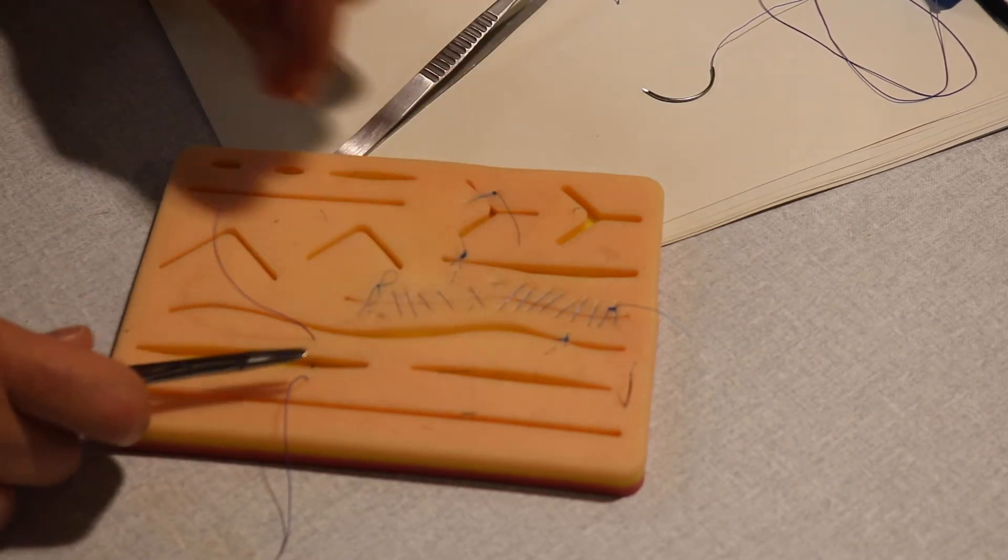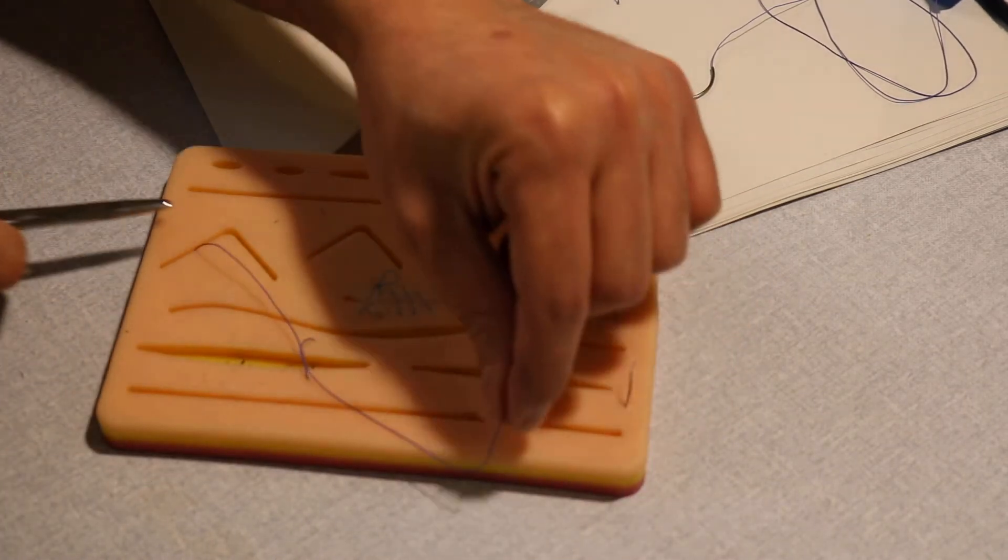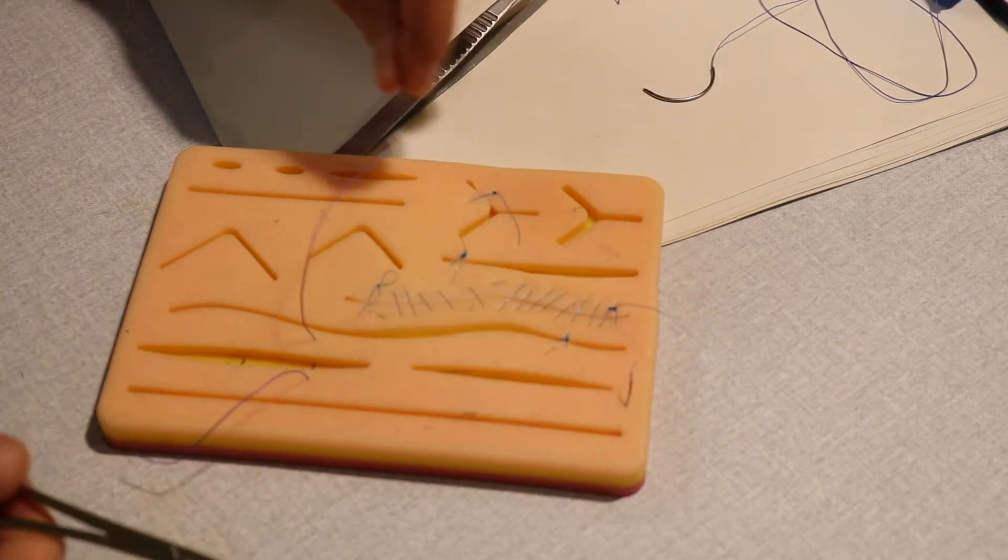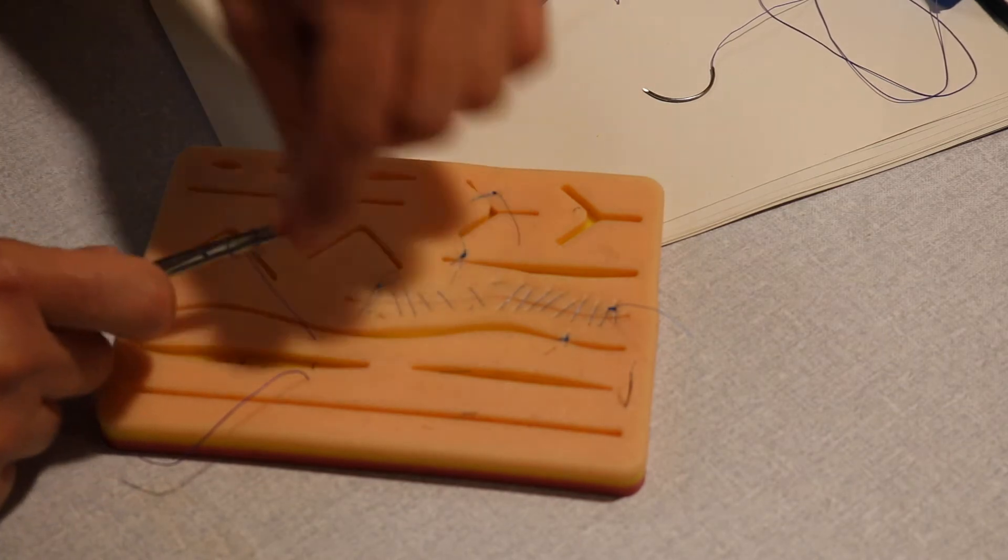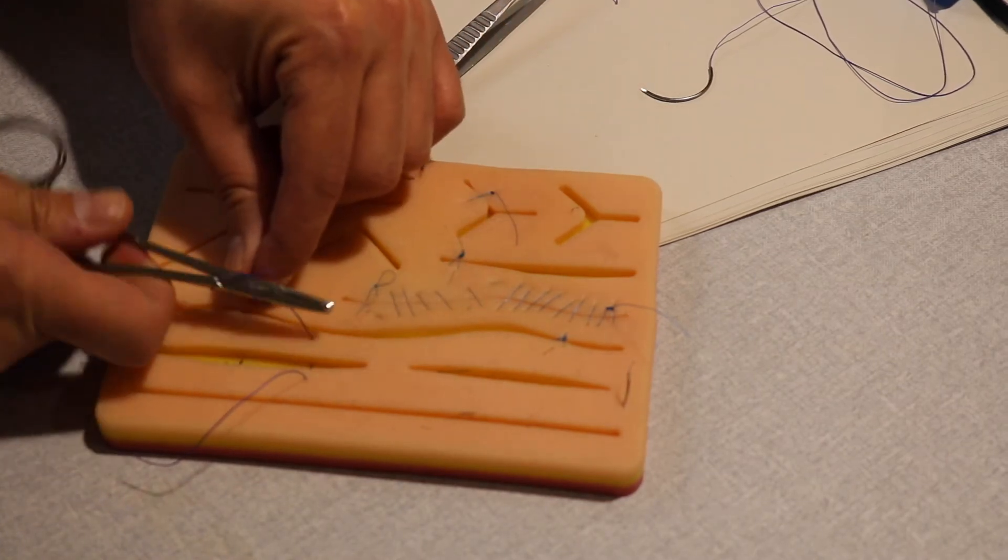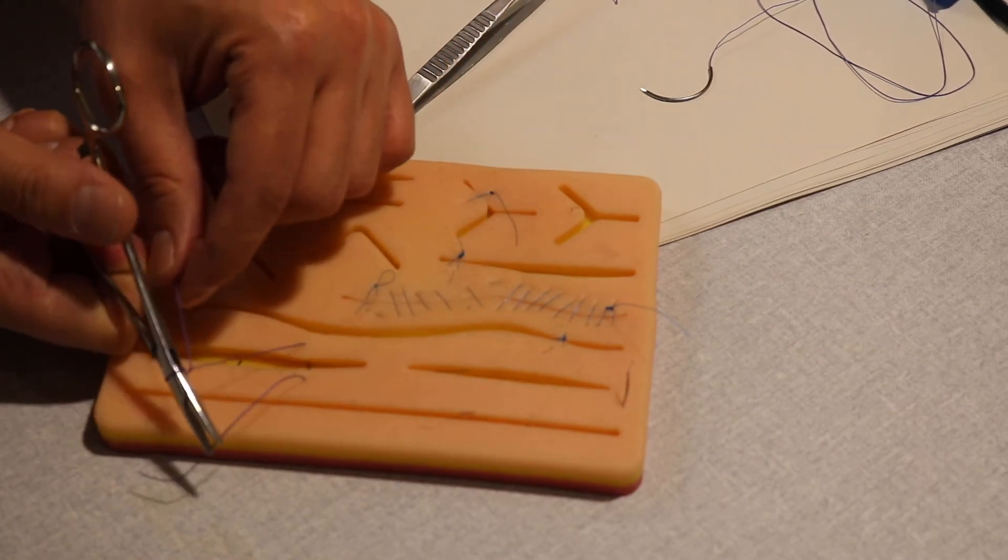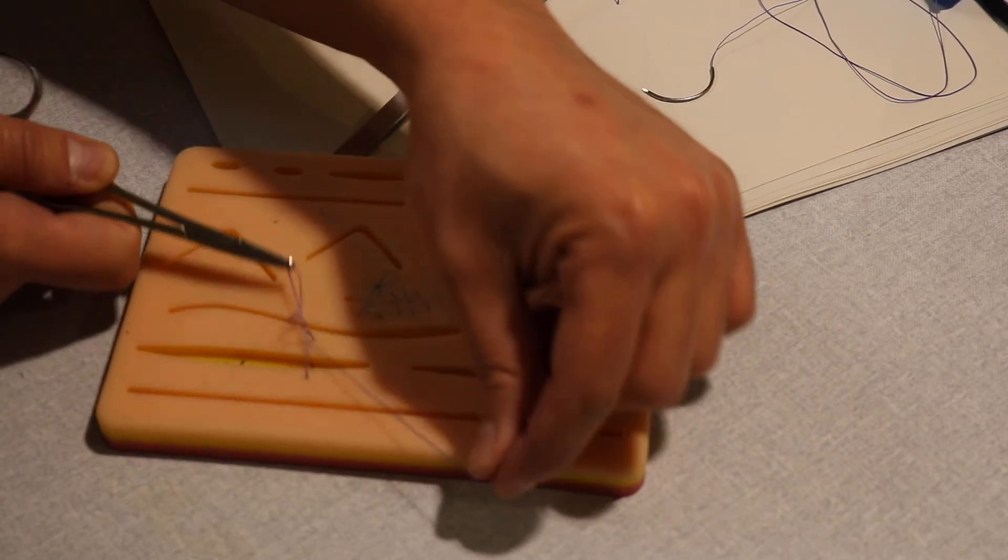The other one, sometimes as you mentioned, when I do one it slips. So one of the other things that you can do: you can do two. That's exactly like the surgeon knot. Do two, it might hold itself.